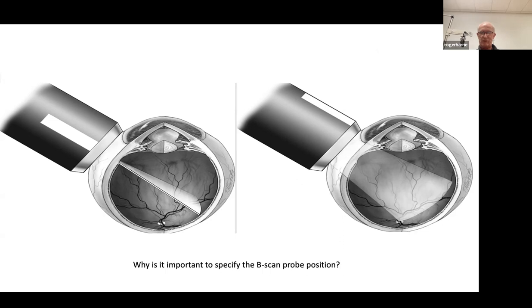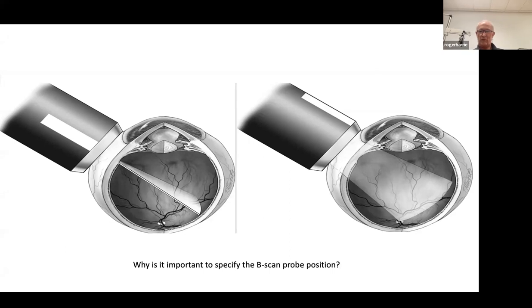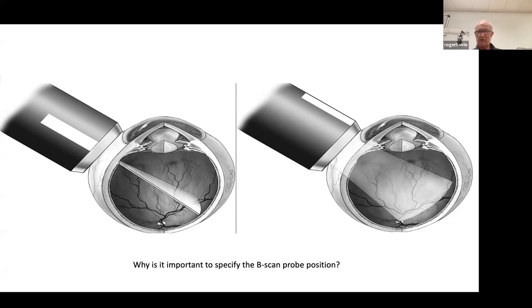To be systematic, just like when you do indirect ophthalmoscopy — you wouldn't just look at one thing with the indirect. And if you had a retinal tear, you certainly want to focus on that, but you also want to look at the entire fundus. So the same thing with ultrasound: you need to have a systematic approach where you put the probe and look at the entire globe.